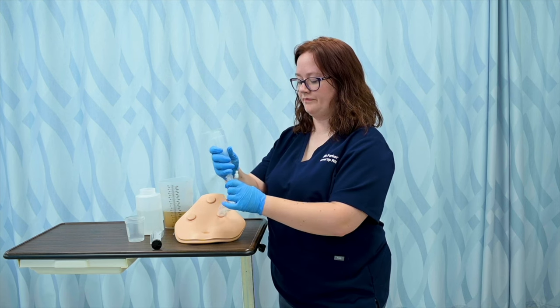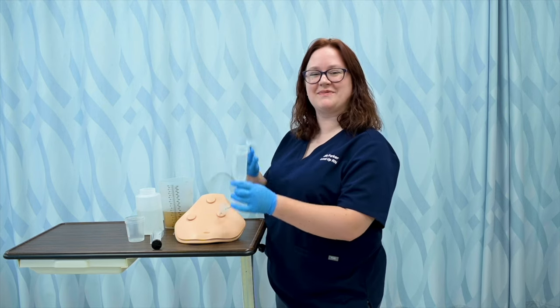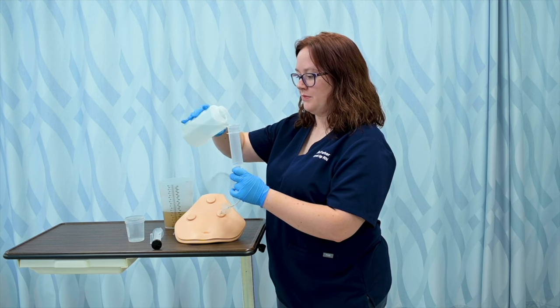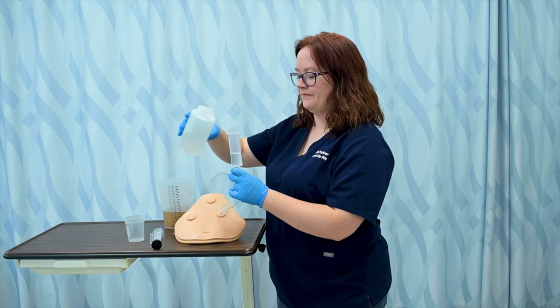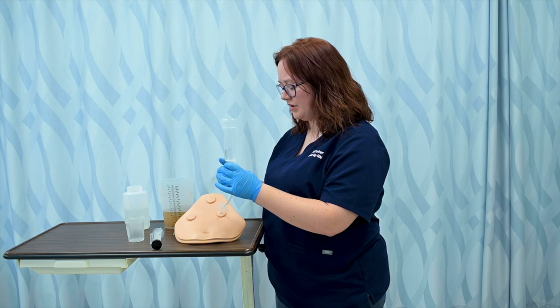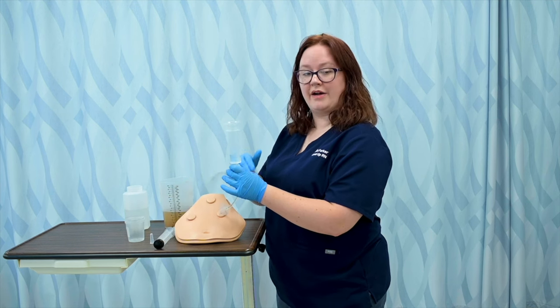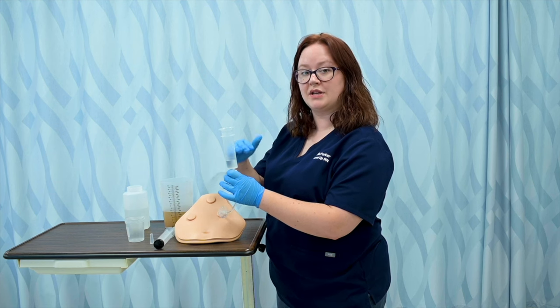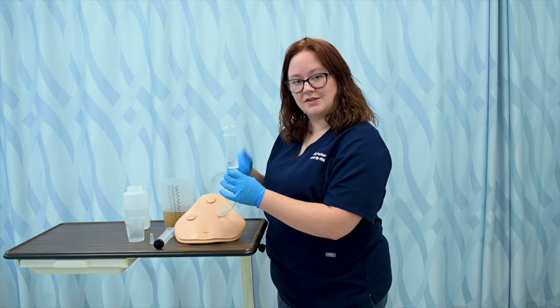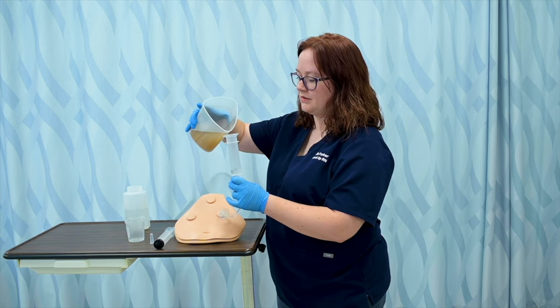I'm going to hold the syringe up — noting that if I hold it down, gastric secretions may exit. So I'll hold it up and flush it. I've got some water here, so I'm going to flush with about 30 milliliters of water. All you need to do is pour it in and it will filter down into the stomach itself. If it's being excessively slow, you are able to use the plunger, but it's really ideal to allow gravity to take effect. You might even see it move tidally — as your patient breathes in and out, the level goes up and down a little bit. Gravity allows it to insert just fine.